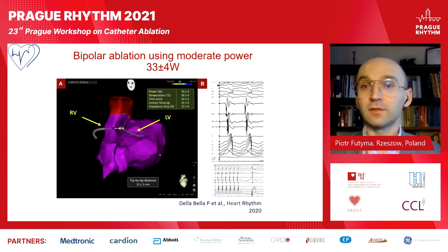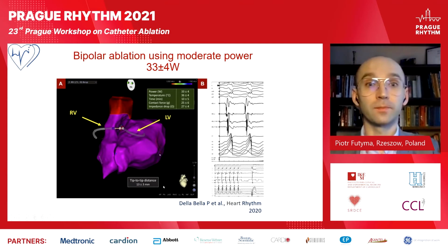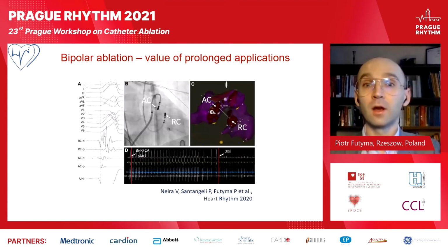Here is another study from Professor Della Bella when they used powers of 33 plus or minus 4 watts. And tip to tip distance was 13 millimeters. So this is another suggestion that we should try to at least start with moderate powers.